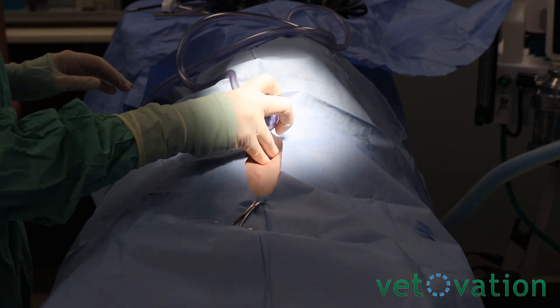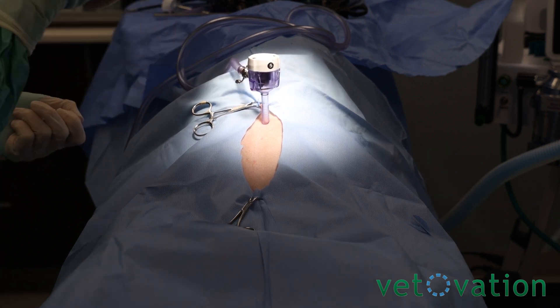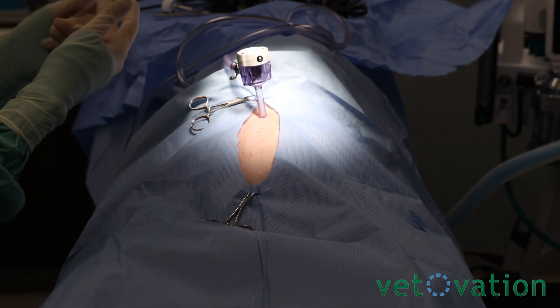I believe we are in. Normally I would pull up with my mosquito hemostats and find the peritoneum, visualize it, and cut across.